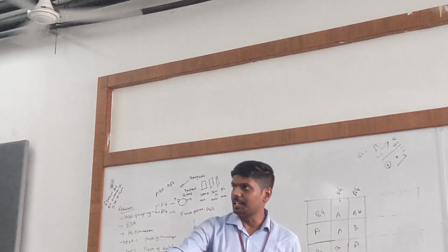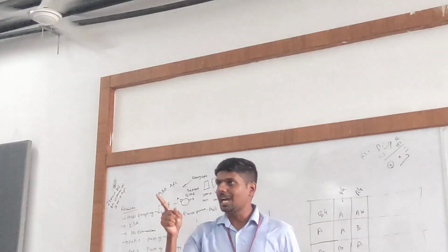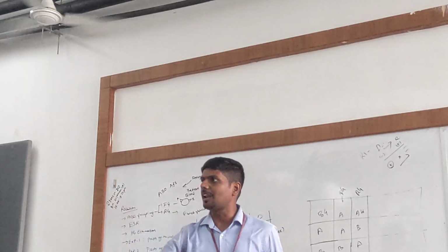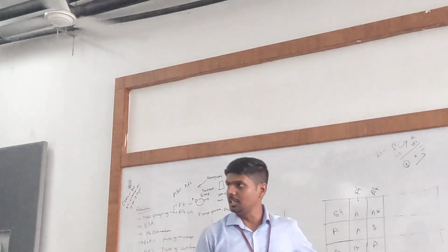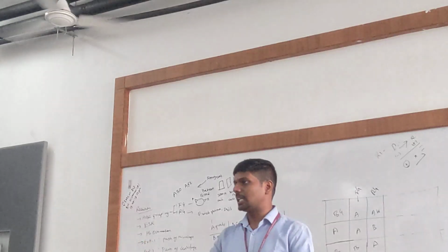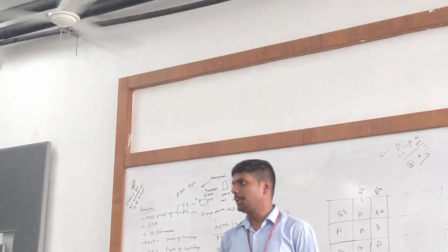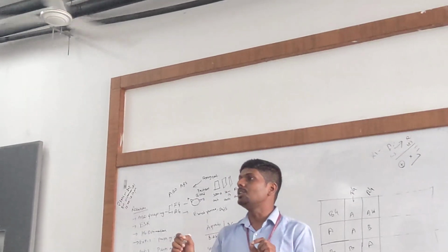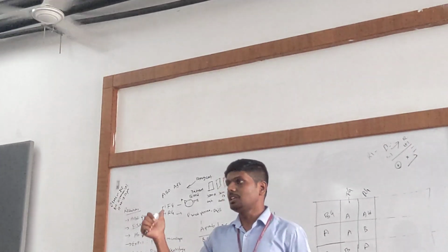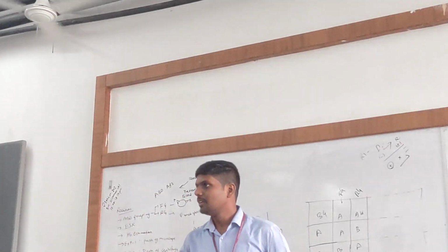I will take her serum and I will check with his cells whether her serum has any antibodies that are attacking Talal's blood cells. If I get any reaction in reverse grouping, I will stop the transfusion. I won't proceed to blood transfusion. So yeah, this is how we will do the blood transfusions. It's not just grouping, it is also the mandatory protocol of reverse grouping.